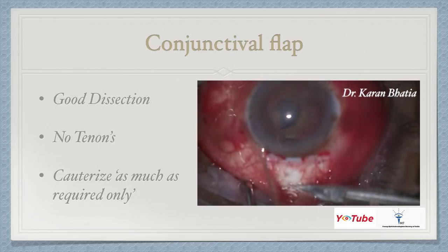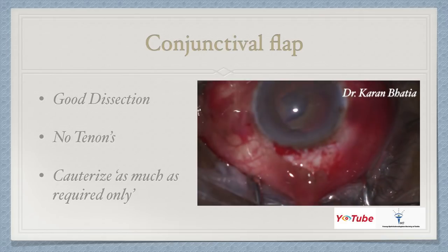The next step is the conjunctival flap. Good dissection is very important for a good surgery. Remember, you should not have any Tenon's tissue there, and cauterize only as much as required. Over-cauterization can lead to tissue damage and increased astigmatism as well.